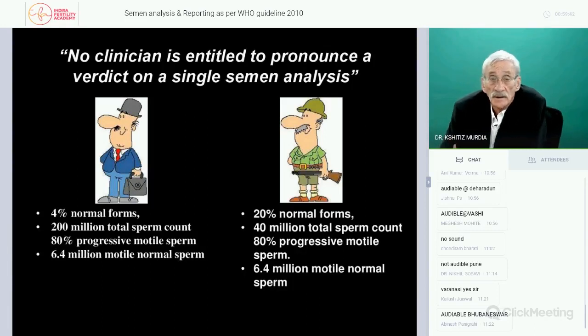There were a lot of issues mentioned in the literature that followed the publication of the manual, because some clinics asked the question, are we now shifting the burden of infertility back to the female because our males are now classified as normal? Which is not a really intelligent comment to make, because these guys didn't understand that you can work with a semen sample that has a low morphology, depending on whatever the concentration and motility can be.